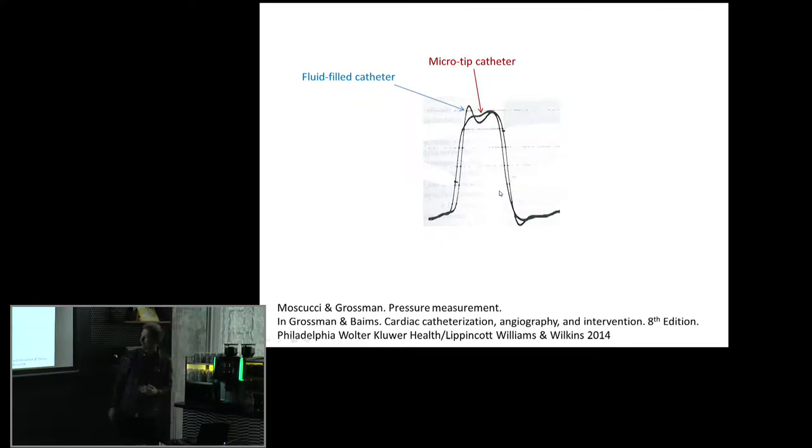And by the way, I recommend this textbook for those of you who are going to do some pressure measurement. This chapter here is very nice. It goes through a lot of relevant problems with these measurement systems.